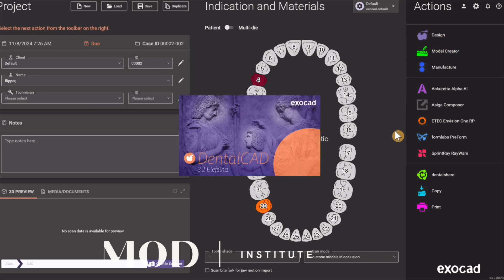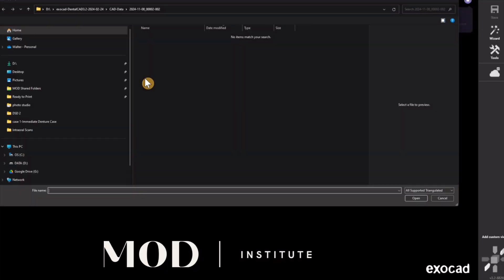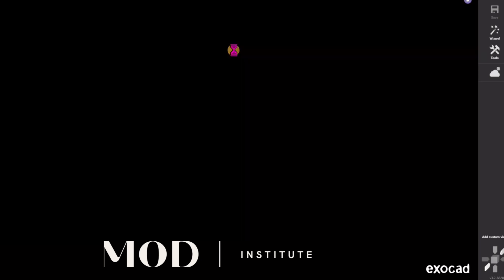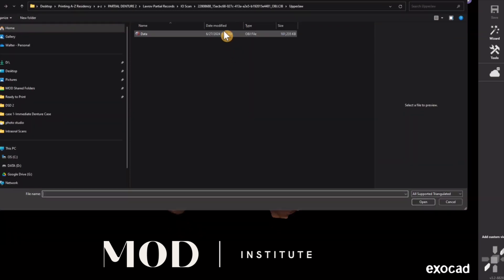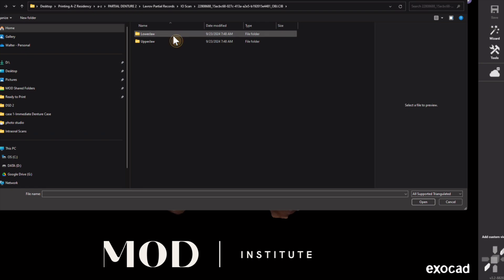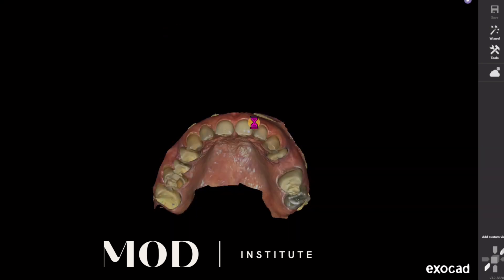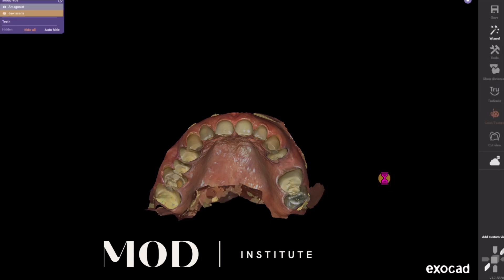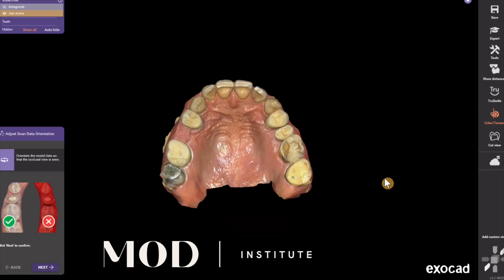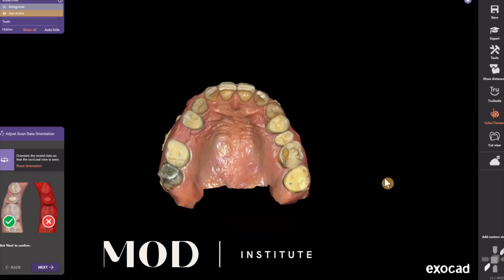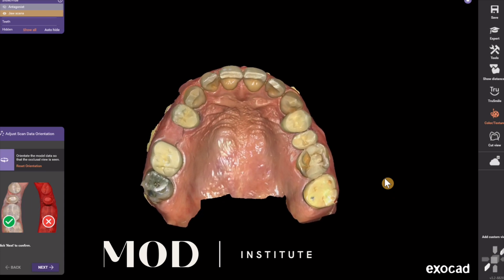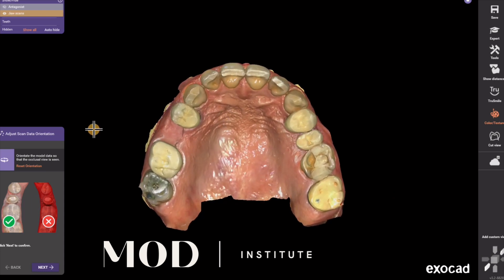Navigate towards the files and load the upper jaw first and then the lower jaw second. The files are going to come in just like before, exactly how you scan them. Once the files are in, step number one is always going to be to rotate the models to a top-down path of insertion, just like that, and then hit next.